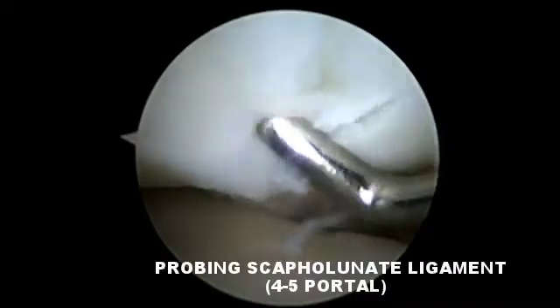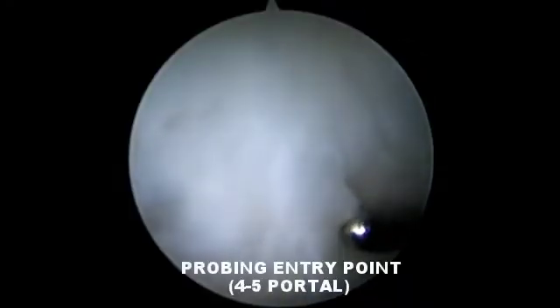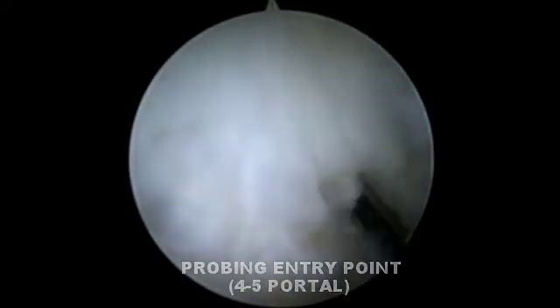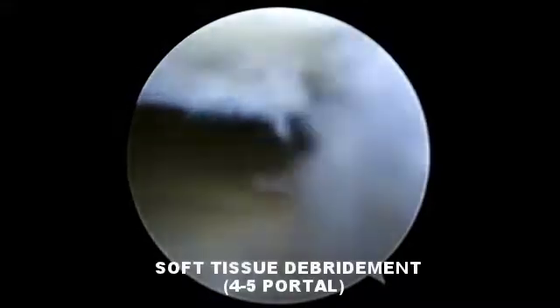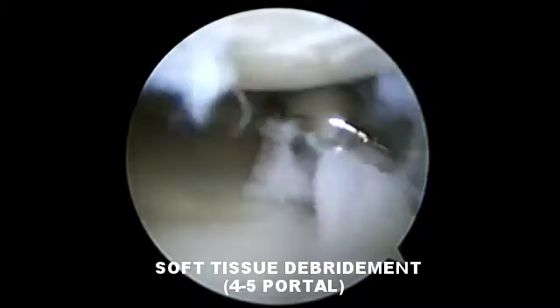A probe is passed through the 4-5 portal and is used to palpate the scapholunate ligament and the dorsal surface of the lunate. A shaver is then passed through the 4-5 portal into the radiocarpal joint and the peripheral soft tissue is debrided.